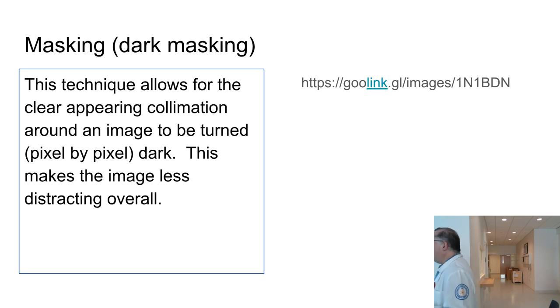So where does masking, dark masking come in? Well, if you're a radiologist looking at these all day, your eyes will get fatigued, right? They've done studies that have found that if we take this border and turn it off, so it's just black, it kind of blends in with the rest of the information, and it's easier on eye fatigue. After all, they're looking at hundreds of images a day, if not more. So shuttering, I like that term because you think of shuttering on a window. We're not removing the collimation. You collimated at the time of the exposure, you did your due diligence.